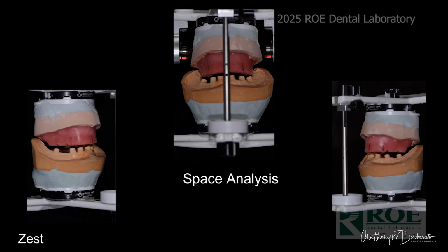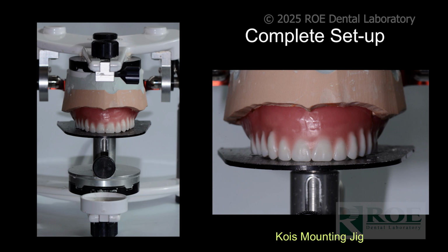Just a couple different views showing how much space we have. Now the other thing nice about this Kois face bow is that when you mount the upper using it, you have this jig that goes on the lower arch. And you can use that jig to set your teeth. Because sometimes you're setting teeth to space and then all of a sudden you look and it's canted and it didn't look like that on the articulator. When you have this, you can use that jig to set the teeth and make sure everything's parallel. So it saves you a lot of time of resetting teeth.